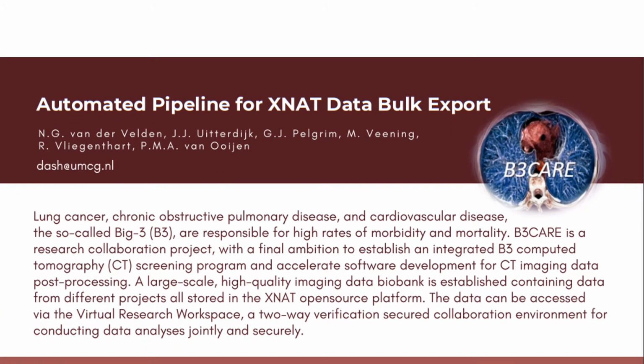Acquiring a pre-selected set of imaging data is critical for the B3 Care project and will accelerate the development of software for CT imaging data post-processing. The imaging data from different projects is stored in the XNAT open source platform on a large-scale, high-quality imaging data biobank. Access to the data is granted via the virtual research workspace to conduct data analysis jointly and securely.